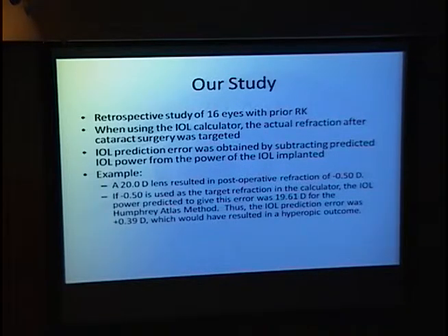So we also had 16 eyes. What we did, when we used the IOL calculator in this study, the actual refraction after cataract surgery was targeted, and the IOL prediction error was obtained by subtracting the predicted IOL power from the power of the IOL implanted. That took me a few times to read and understand when we were making this paper.